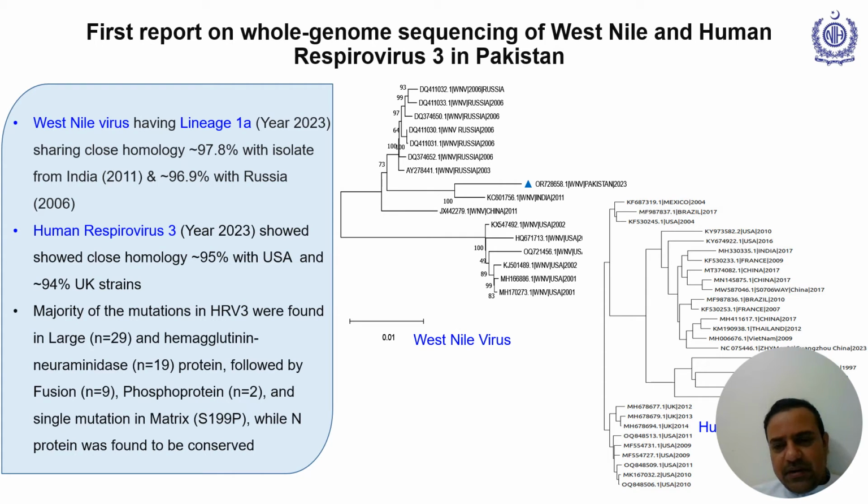And in the respiratory swab of this patient, we again used this metagenome approach, and we identified the human respirovirus, or the parainfluenza virus. This virus again showed some unique mutations in different segments. So again, you can see how next generation sequencing and the metagenome approach have helped us in the identification of pathogens and in exploring their genomic diversity.